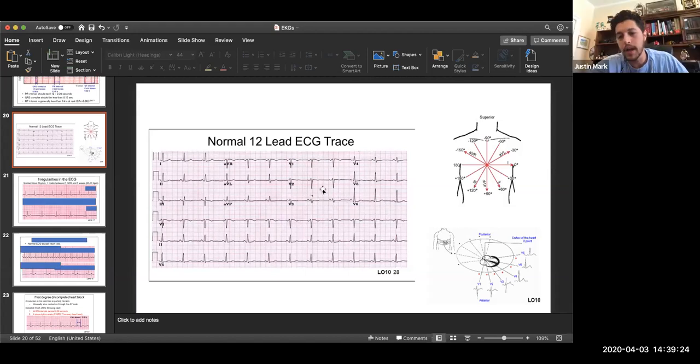Okay. There's going to be natural variation when you look at real EKGs, because as I said, everybody's heart is going to be slightly different, but that doesn't necessarily mean there's pathology. Also, an important point is you're not just going to get an EKG in real life and say, hey, what's wrong with this person? They're going to give you symptoms, right? The person's going to come in with symptoms. And if you take an EKG on somebody who's perfectly normal, if they have a little variation in the EKG, it doesn't necessarily mean that there's something wrong with them. Okay, so that's an important point as well. For us, we're given EKGs. We may or may not be given all the symptoms, but yeah, that's my spiel. All right.